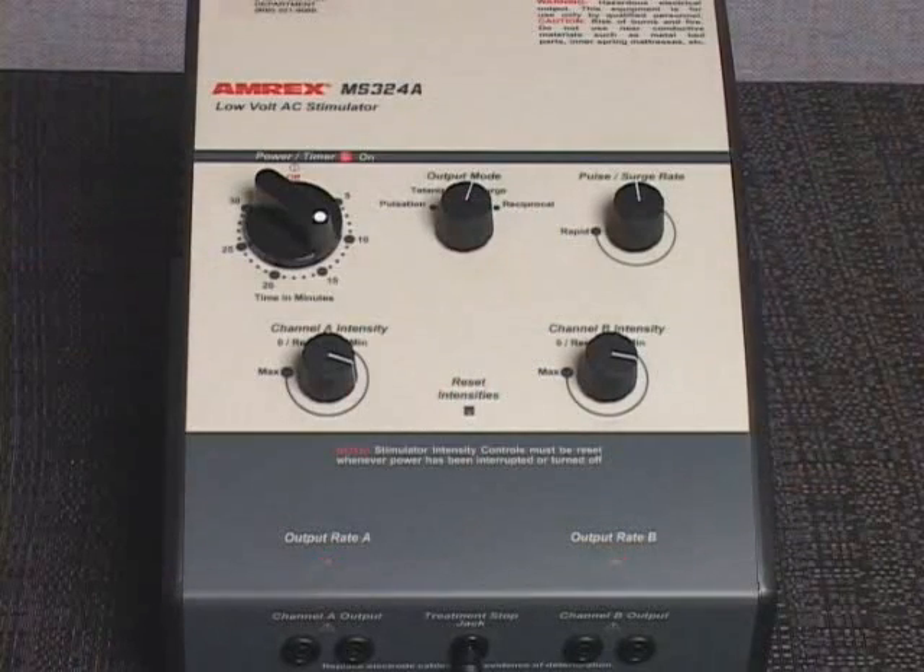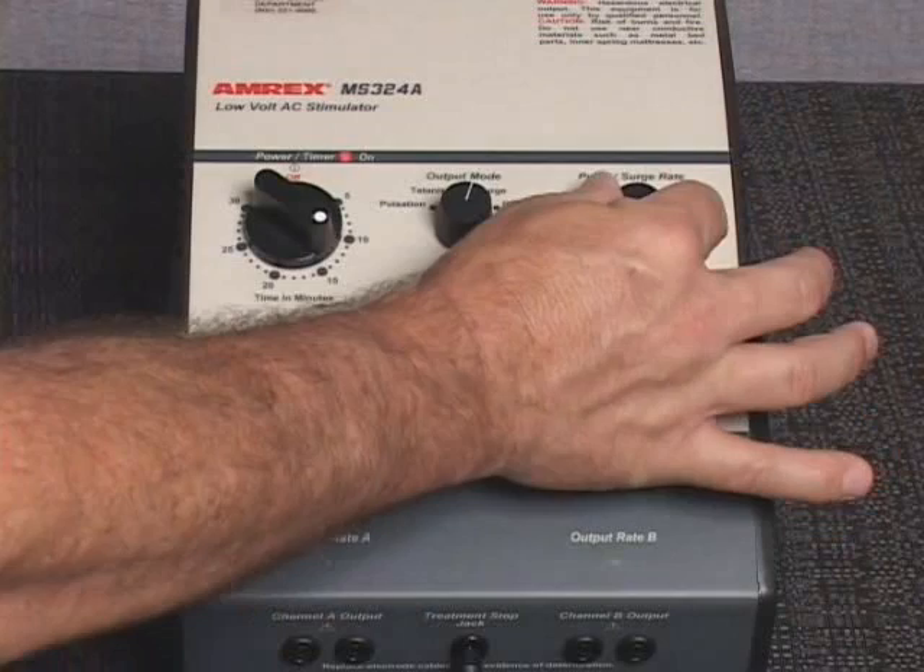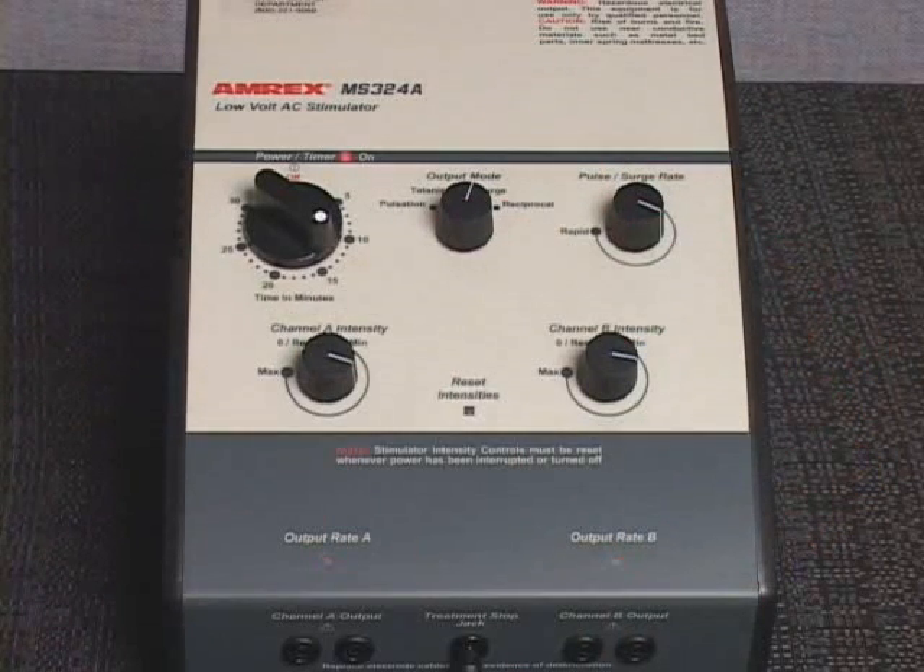If desired, select an alternate output mode of pulsation, surge, or reciprocal, and adjust the pulse surge rate control setting. The output rate indicator light or lights will reflect the output rate selected.